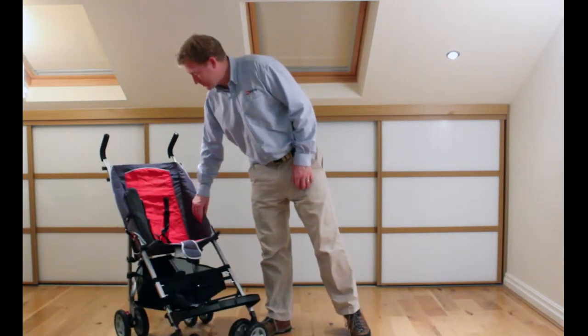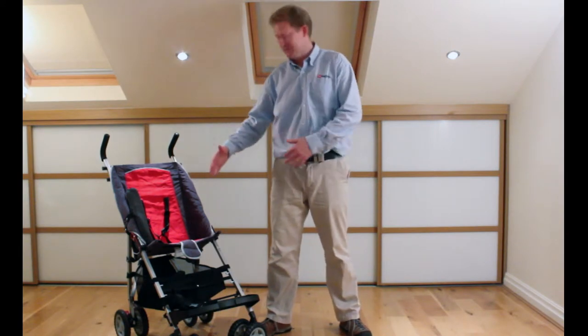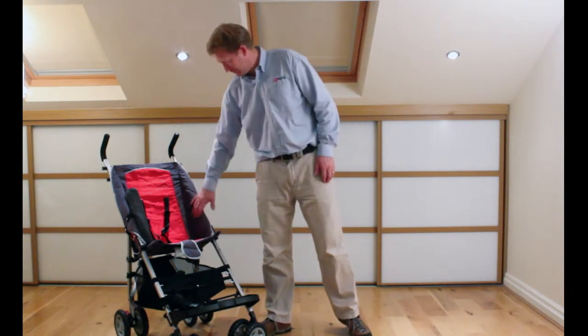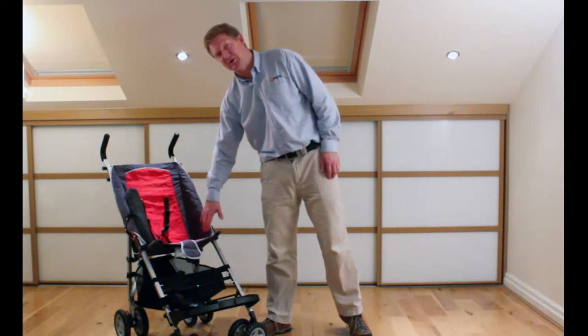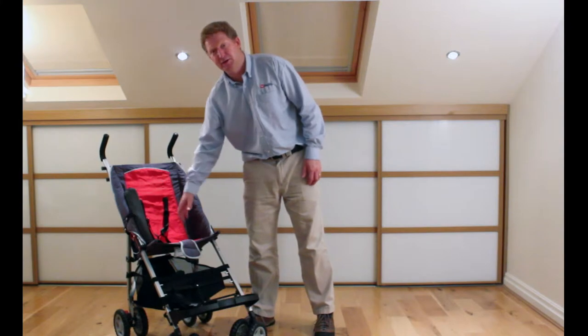We've got lateral supports which just help keep the child centered so they don't hurt themselves. It's not a hard surface but just gives them a bit of extra padding to lean on.